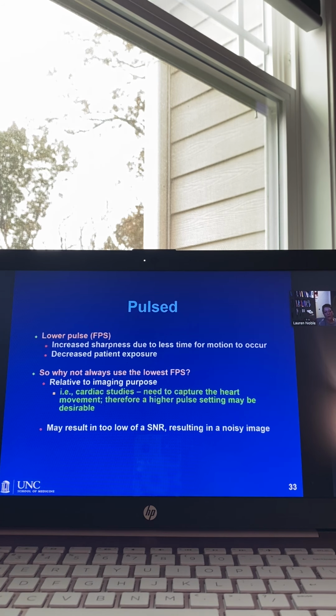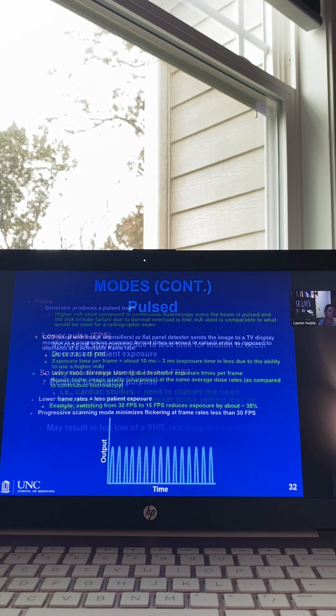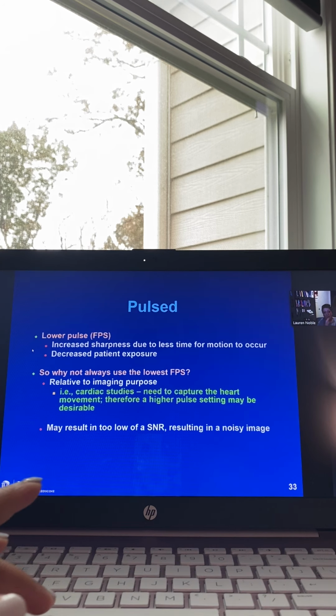That's something if you all were to go into cardiac cath. So when you do your fluoro rotations, pay attention to the control unit and see if you notice these numbers and what is being selected for the particular study you're doing. For pediatrics, you might see that they're using lower frame rates here to reduce patient exposure. Okay. All right. You think you can keep that information separated?